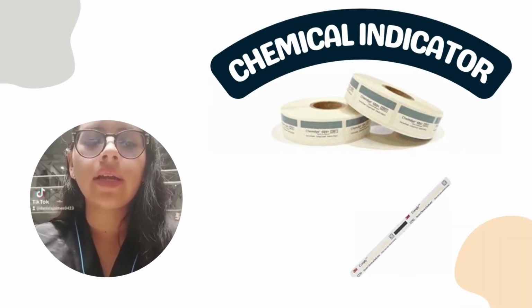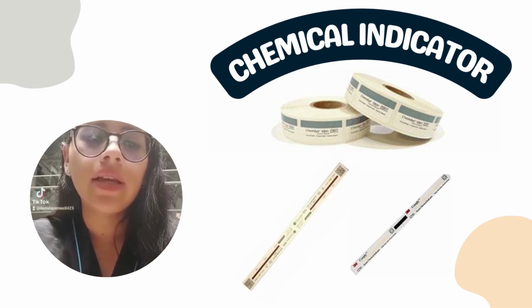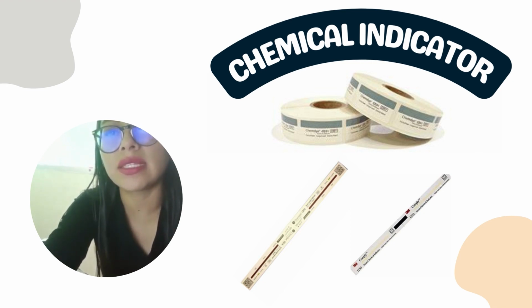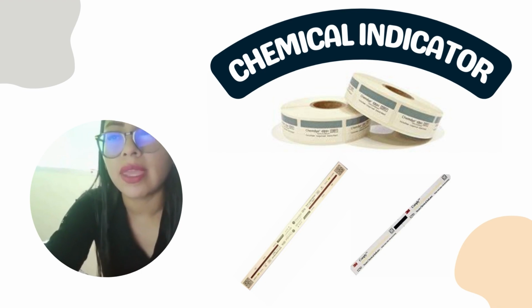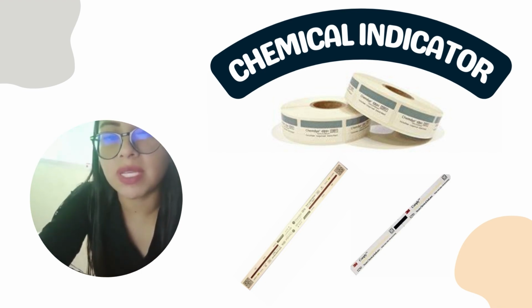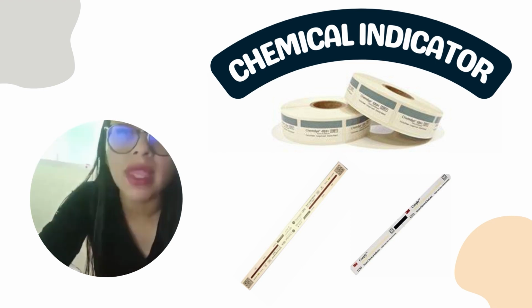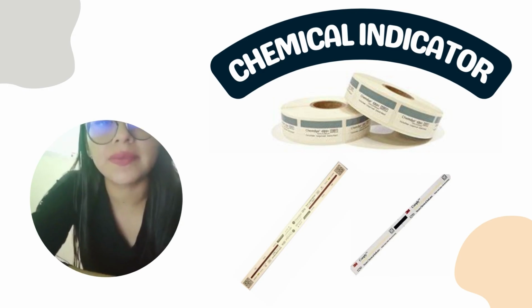Chemical indicators. Type 1, or external or process indicator. Type 2, or specific test indicator, used to evaluate the air evacuation system, such as the vacuum sterilizer Bowie-Dick test.